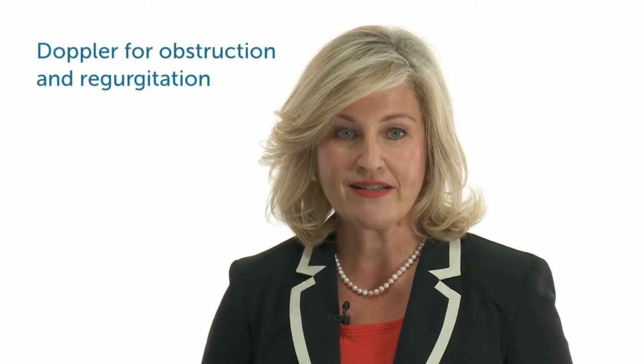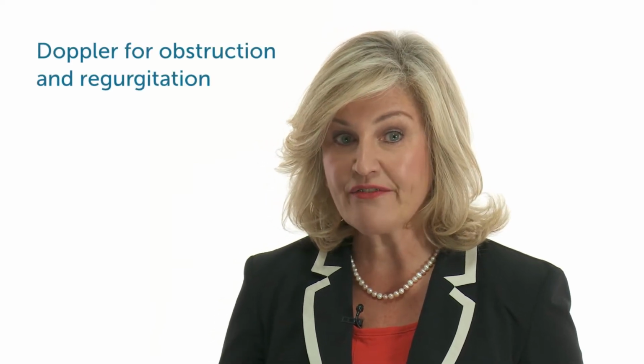So let us start with the mitral valve and see how we can use Doppler to look at two important complications: obstruction and paravalvular regurgitation. Yes, we need to discuss the issue of gradients, so let's go to the scanner.